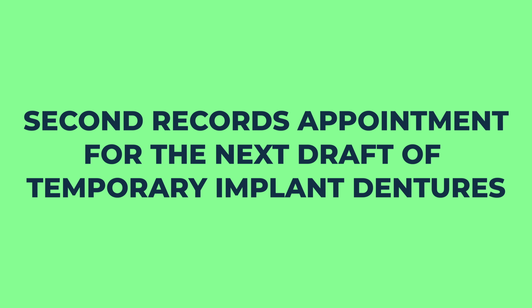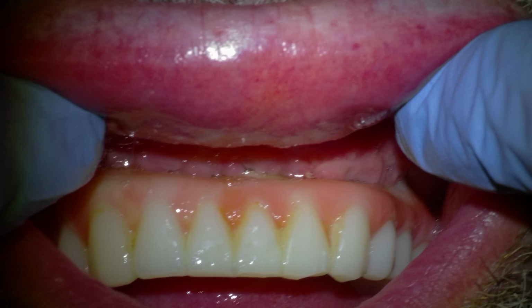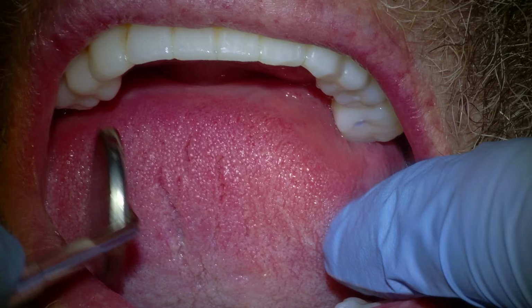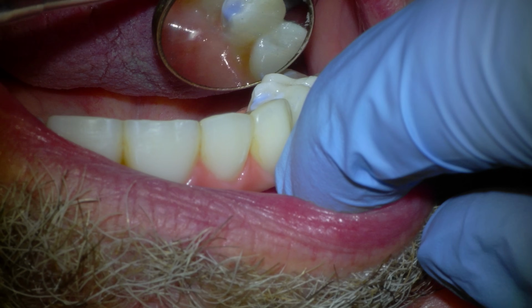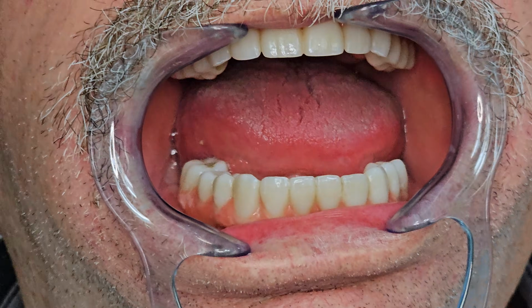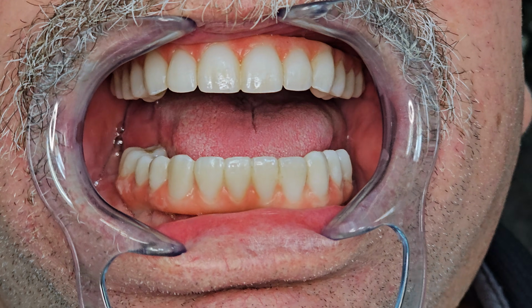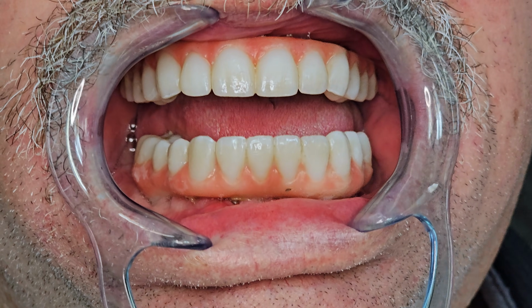So in our case, everything was fine, and the patient comes in for an appointment with me, and the oral surgeon at this point is effectively done. The objective for me at this appointment is to start making a second set of temporary implant dentures that are adjusted to how the bone and gums have healed, and with all the changes the patient wants and the changes that I want, to ensure that the final prosthesis will be exactly what they want.